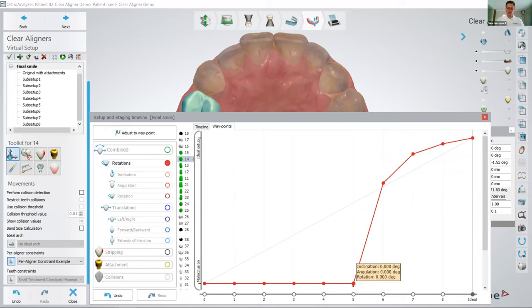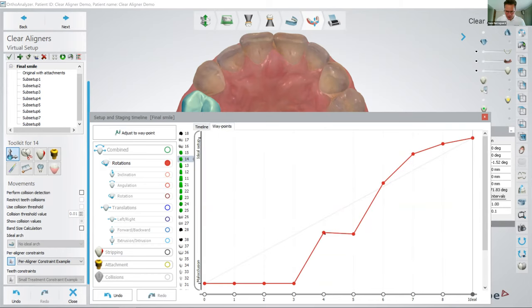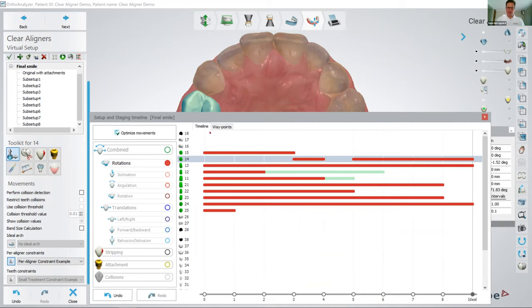And if I want to increase the speed, well, then I can just raise up the speed. And that will, of course, if I go like this, then that will affect my timeline. I can also set it to 0, meaning that I will have a break somewhere in the middle if I hit exactly the same height like that. Then you see there's a break between aligner number 4 and 5.